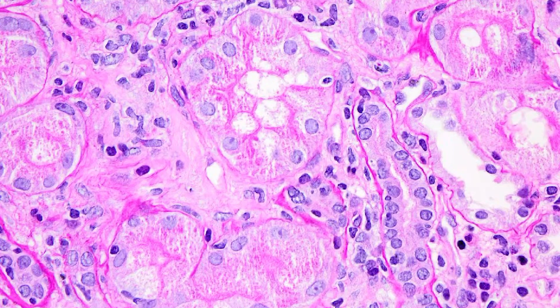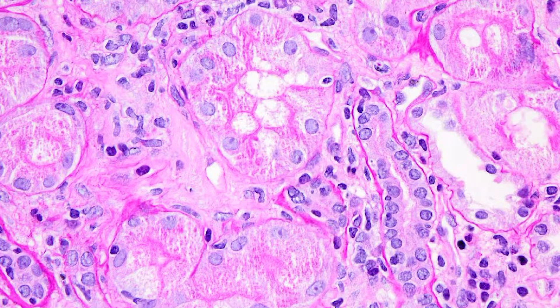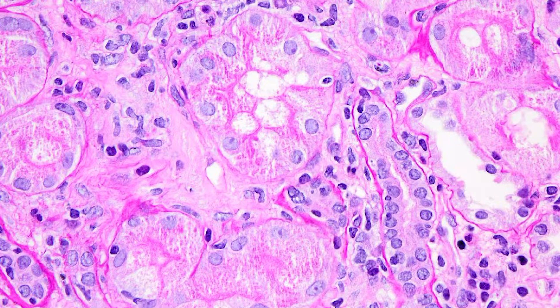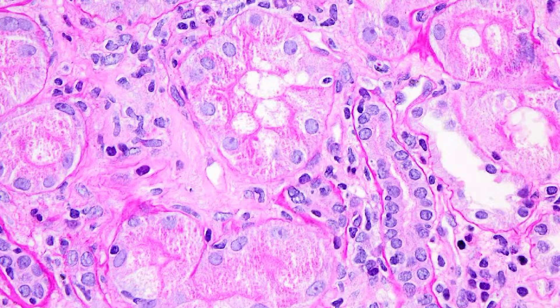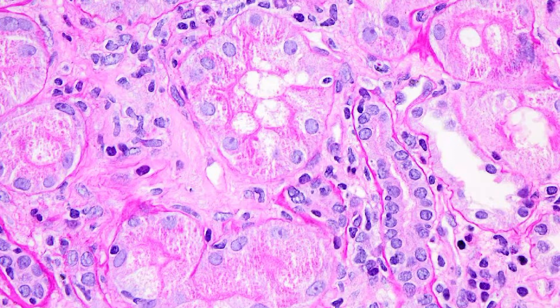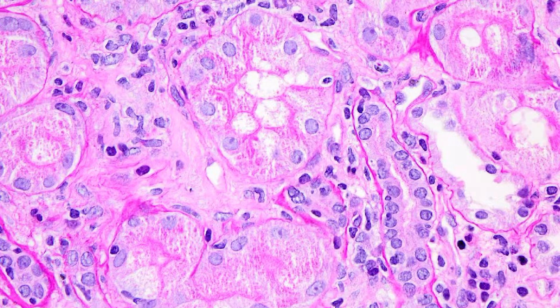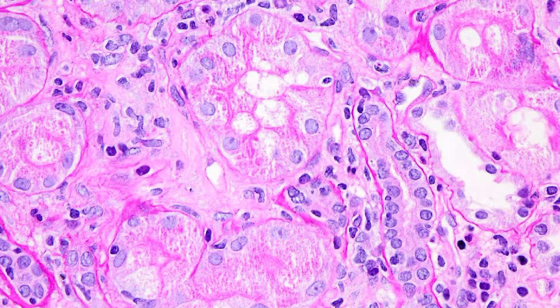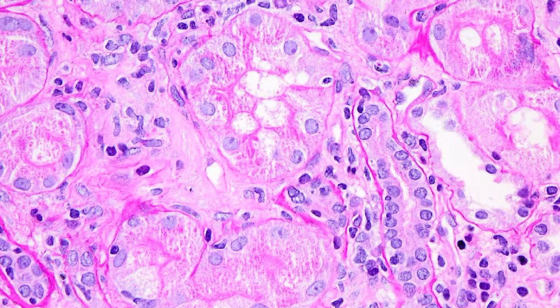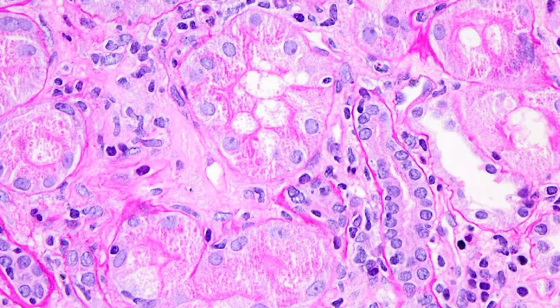In this picture, as we look at higher magnification, we can see we have three tubules within the image, which importantly do not show severe tubular atrophy. Banff characterizes severe atrophy as less than 25% of an unaffected tubule, one with pronounced tubular basement membrane wrinkling, or endocrine-type atrophy.